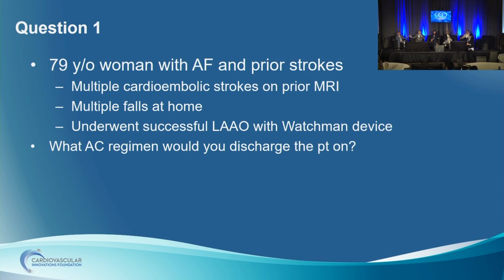So, yeah. But here, as an interventional cardiologist, there's no device that I place inside the heart to prevent device thrombosis by the use of anticoagulant medications. What you're trying to do is protect that device during which time endothelialization occurs. If you go with a stent, an ASD or a PFO closure device, or closing a patent ductus arteriosus, whatever you close, you're going to be using antiplatelet medications. So this is the debate that we had amongst EP versus interventional, because in the EP realm, it's all anticoagulant. That's a very comfortable methodology for them.